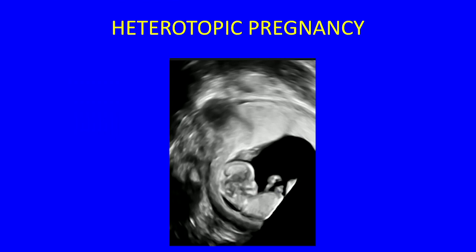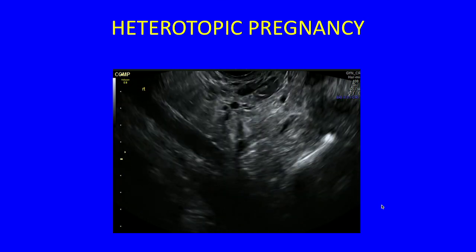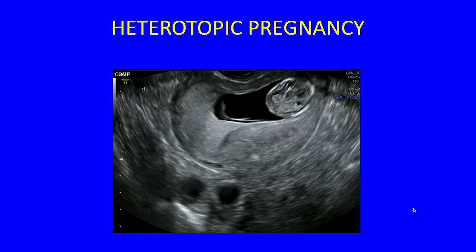So I took a 3D, and I realized and noticed, yes, that little nub in there seems to communicate with the uterus, and you can obviously see a viable intrauterine pregnancy just below it. So this is what it looked like on panning through in the longitudinal plane. So there's that little nubbin, there's the intrauterine pregnancy.